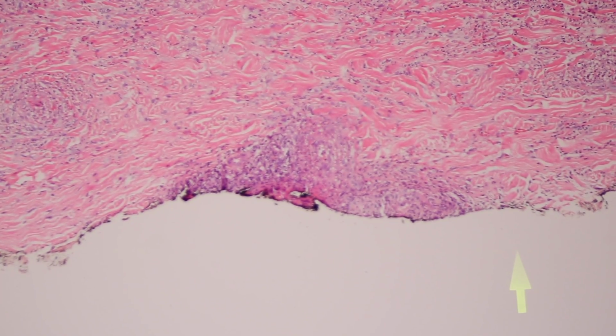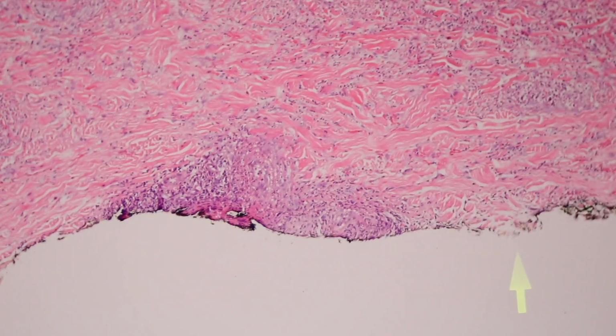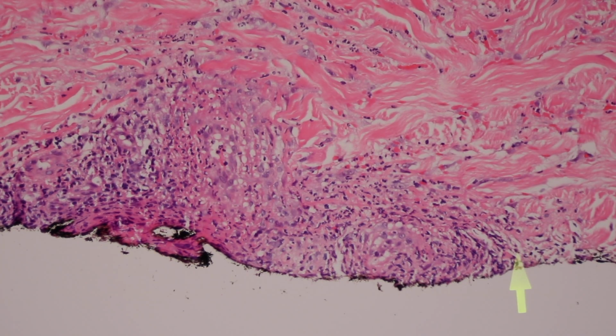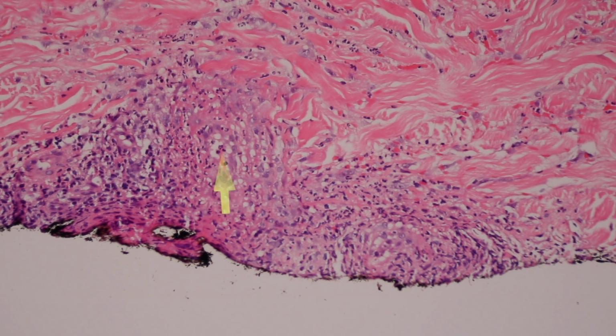And again, look down below, we can see that the problem here is not all the neutrophils and fibrin up here, but actually the involvement of multiple vessels down here. Because sometimes in leukocytoclastic vasculitis, in fact, relatively often, in addition to the vasculitis, in the lumen of the vessel, we'll start to see fibrin thrombi formation. So as the vessels get damaged, they fill up and can become occluded by fibrin thrombi. So that's a good thing to keep in mind.